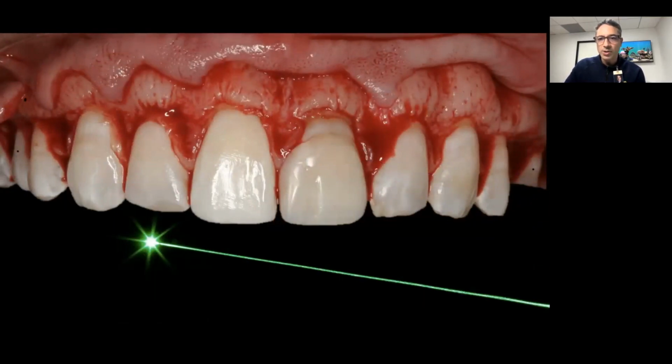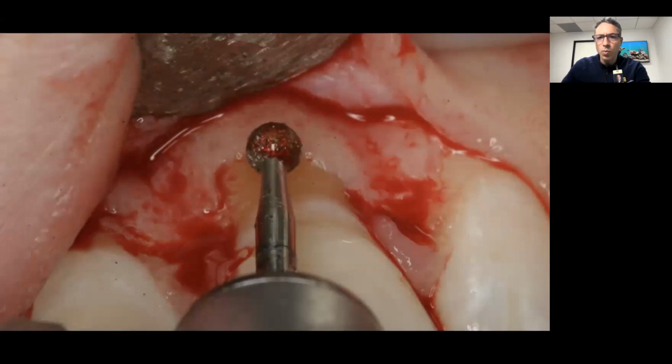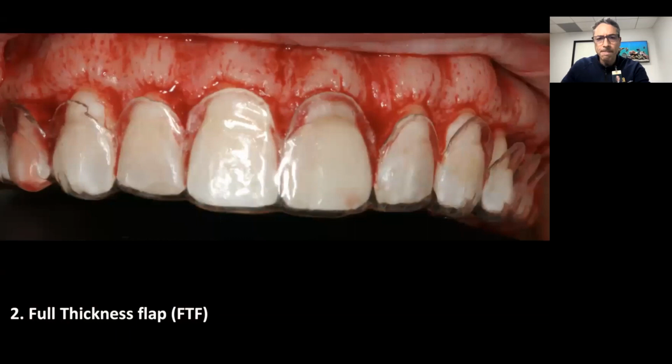Even if it's a hard tissue laser, you won't get the finesse in bone adjustment, in bone plasty, osteoplasty, ostectomy, compared to what I'm going to instruct you in our courses. There are two burrs you're going to be using: the end cutting burr and the round diamond and the round carbide, to create a new shape of bone. Here is the round diamond. It's a medium size. It's like a number 6 or 8.